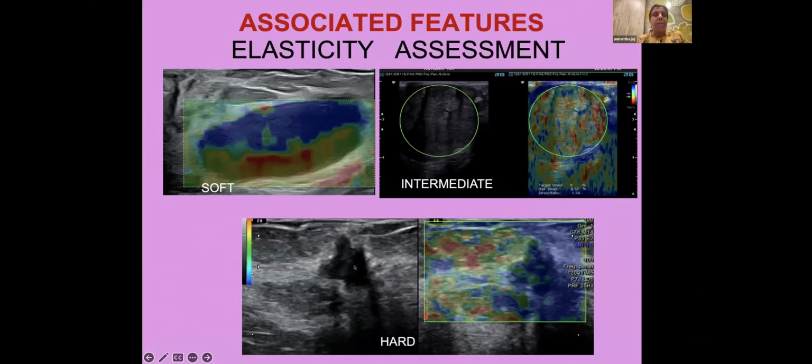It has been included in the BI-RADS, but you cannot trump elastography findings and ignore the morphological findings. So first come the descriptors, and this is an add-on. Typically, I would say that this is used to upgrade from a 3 to a 4 rather than vice versa, at least in my practice.